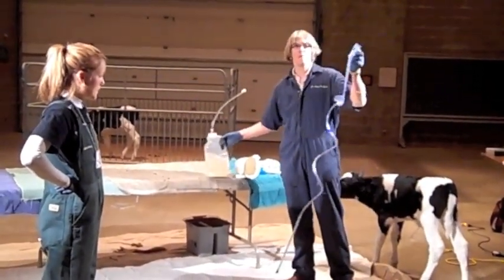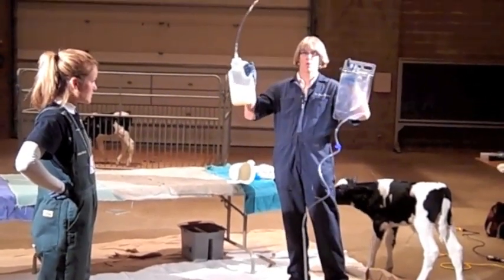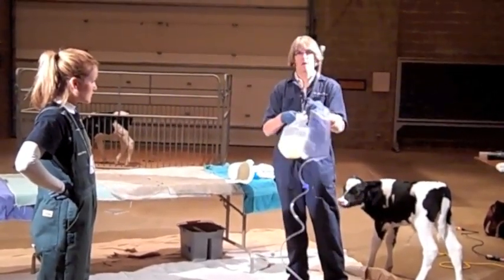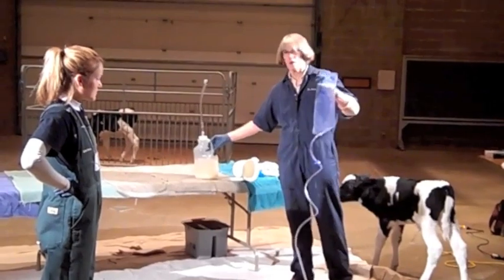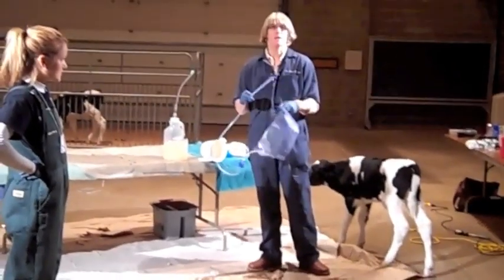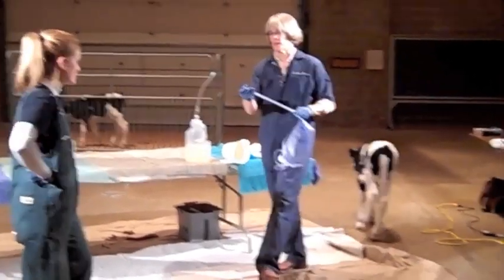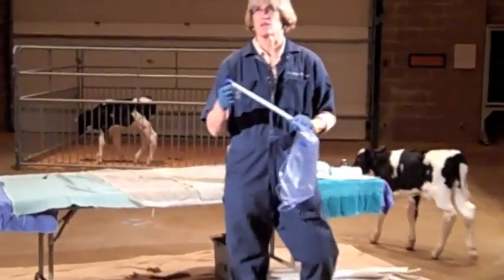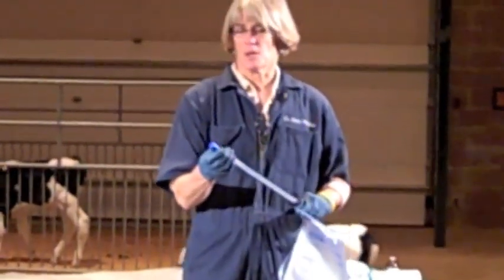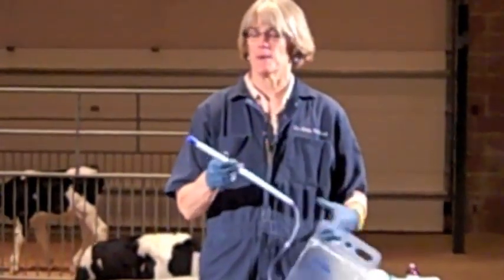Esophageal feeders come in two, three, or four quart capacity, and they come in short tubes and long tubes. They'll always have a bulb on the end, and that's to keep from two things: it's to keep from going down the wrong pipe. This bulb should be big enough that it's really hard to get it into the trachea or the windpipe.